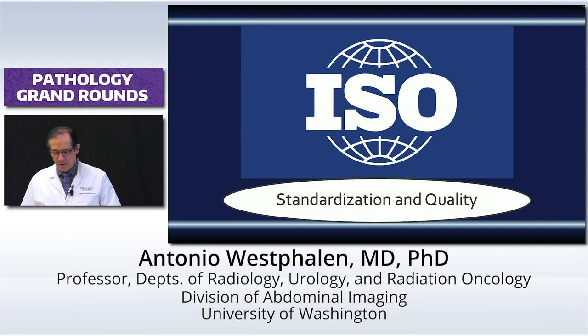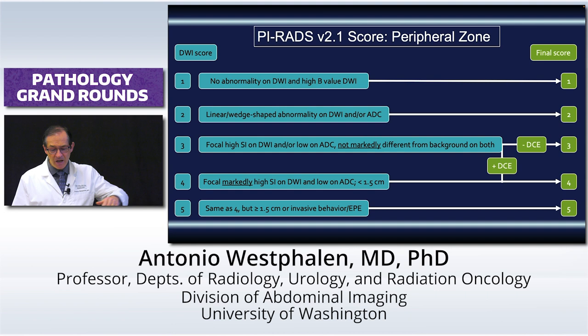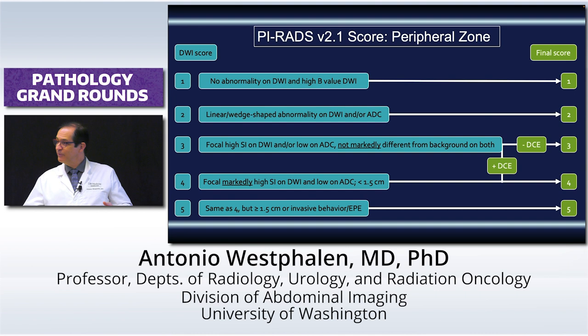But what can we think about it? It's basically a way to standardize MR interpretation and acquisition and improve quality, like an ISO type of thing. This is not of a lot of interest to you, but it's good to know that it's not perfect, and when you look at this, you can see it's not perfect.